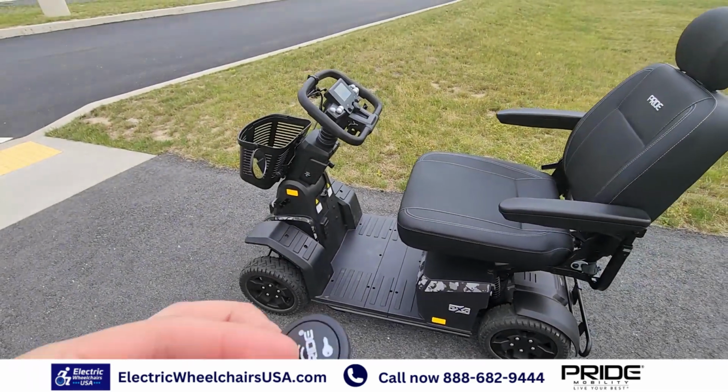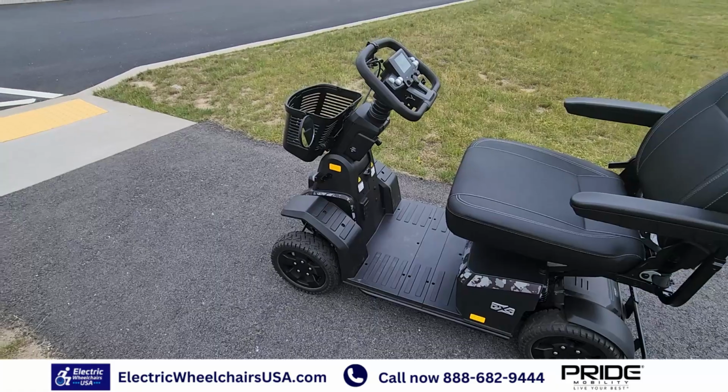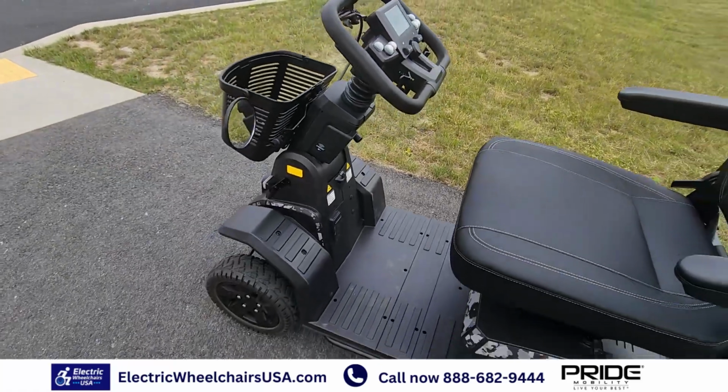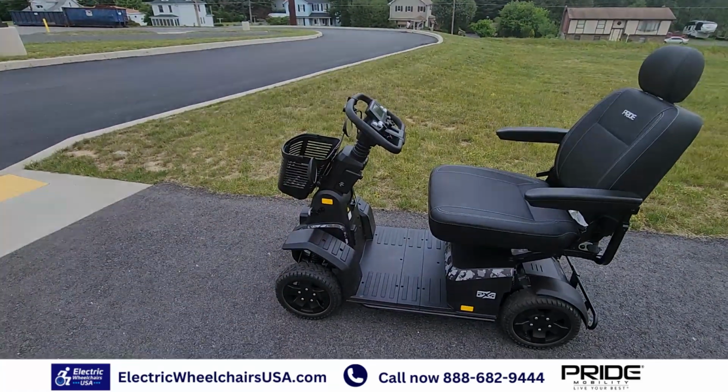By the way, you get 2 sets of keys. Don't want to lose these. If you happen to lose both of them, they'll have to send a technician to you to reprogram this. So that's something to keep in mind. Otherwise, you won't be able to use the scooter. So they'll send you a new set of keys, but they have to reprogram the tiller.